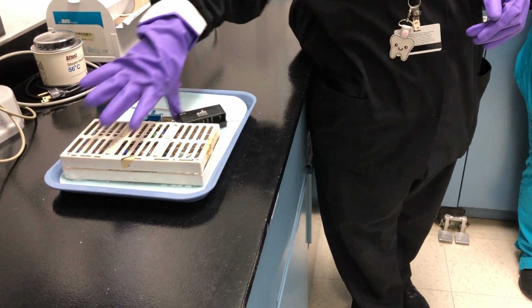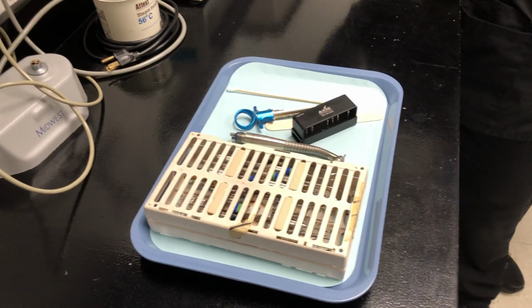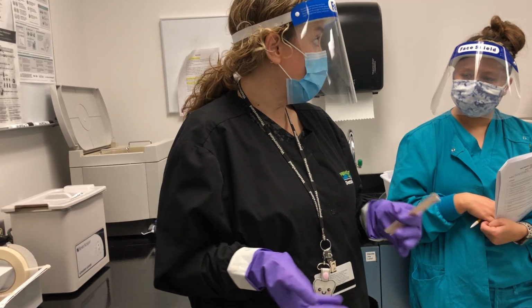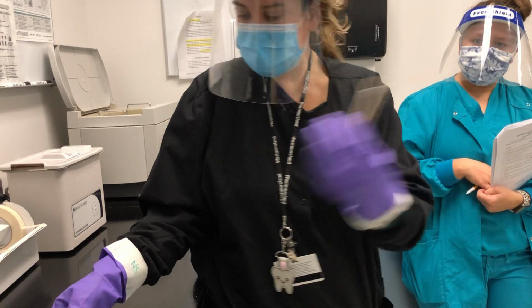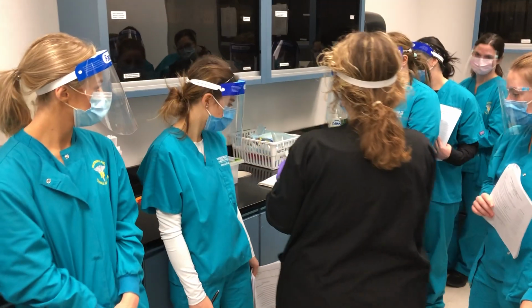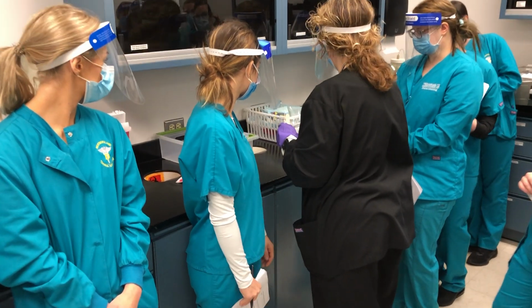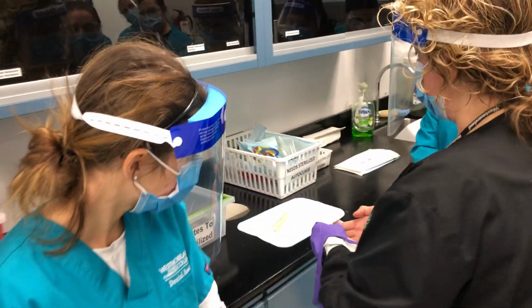Now, the next one says dispose of regular waste in appropriate receptacle. So what would be considered regular waste on this tray? The paper and the tongue blade. Okay, good. And then any other gauze that may be on your tray that isn't covered in saliva or blood. Right now we just have the cotton tip applicator, the tongue blade, and the piece of paper. So you can do the same thing. Over here is another little receptacle. I'm just going to move these down. And we're just going to set that right in front of the normal garbage receptacle, okay?